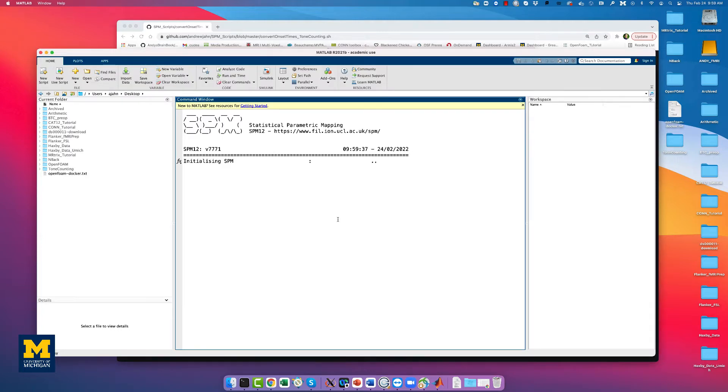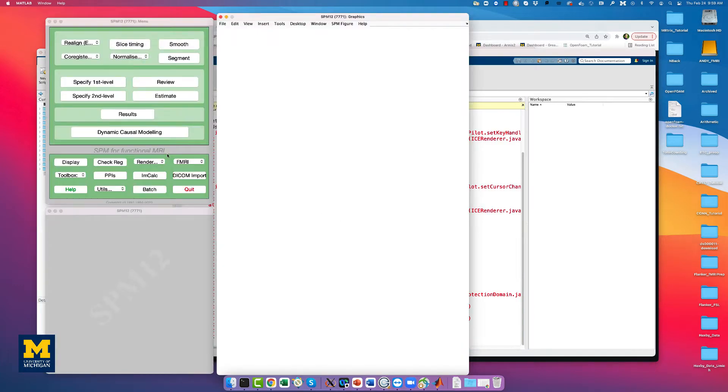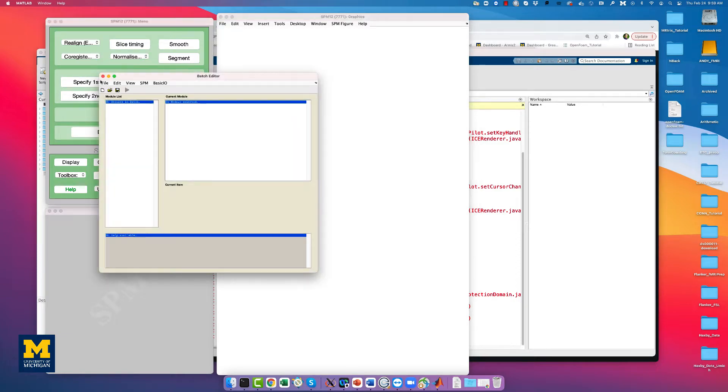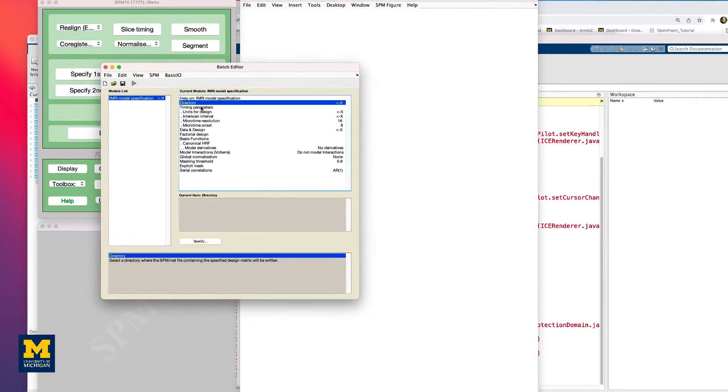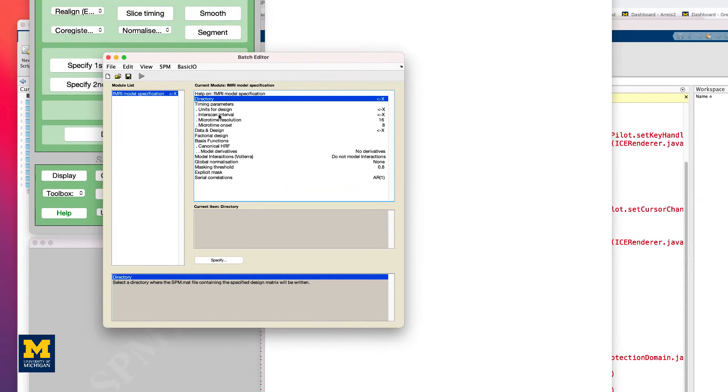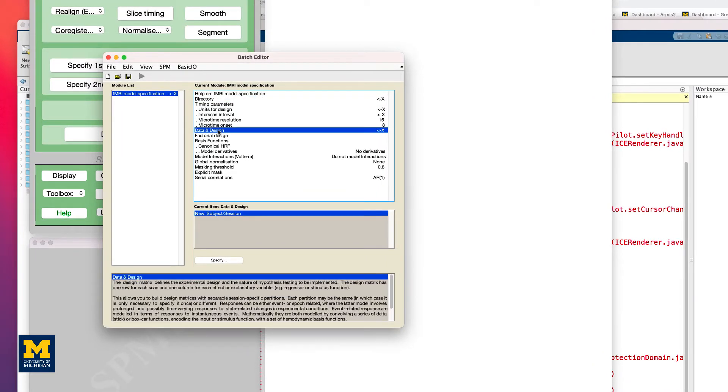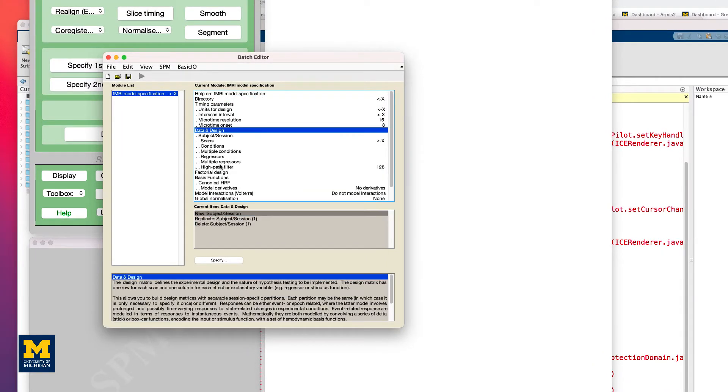Now, open a MATLAB terminal and open SPM FMRI. From the GUI, click on Specify First Level. We're not going to input all the data and the directory. We're simply going to see how to change the basis functions for a particular condition.